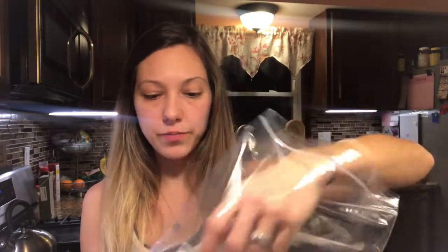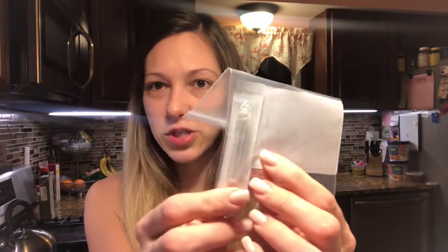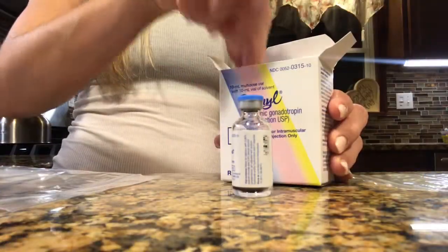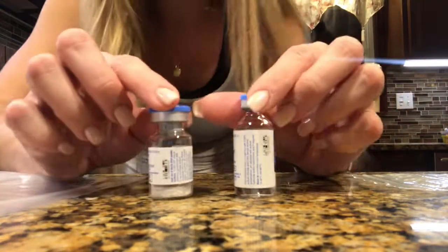Let's see what we have in here. We have the Pregnal, which needs to be mixed — Pregnal is a form of HCG. I have little alcohol swabs, I have the needle to inject with which is very teeny tiny, and then I have the needle to draw up and mix the meds with.